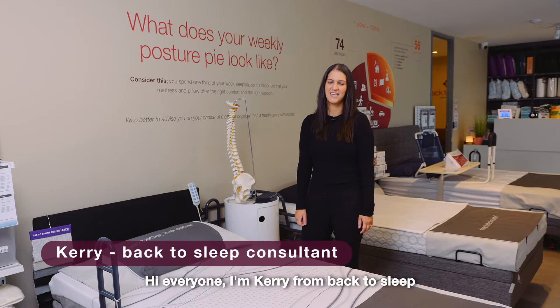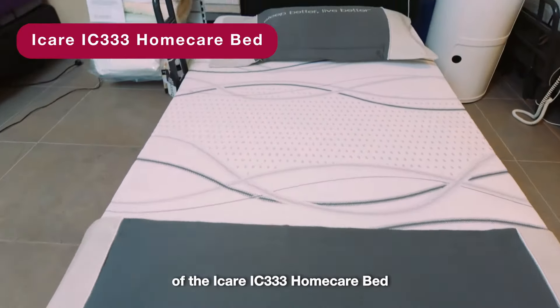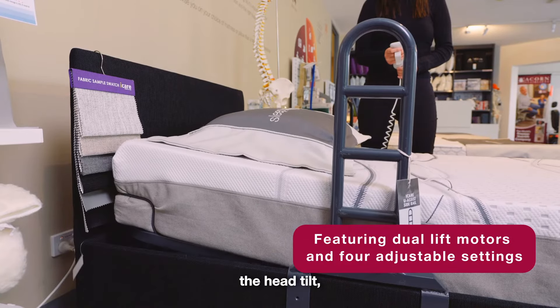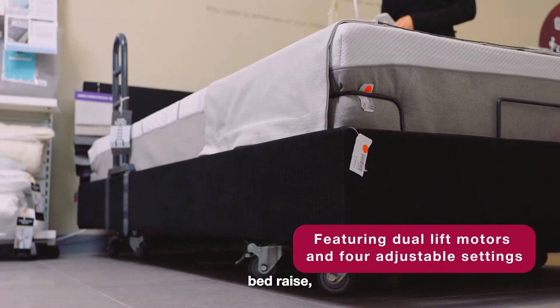Hi everyone, I'm Kerry from Back to Sleep and I'm going to show you the four key functions of the IC333 Home Care bed. The four adjustments on this bed are the head tilt, the knee break, bed raise, and Trendelenburg.